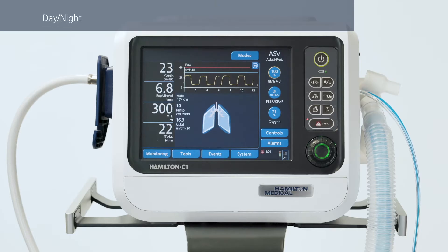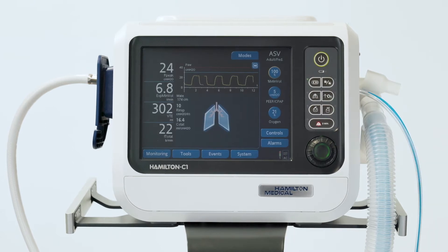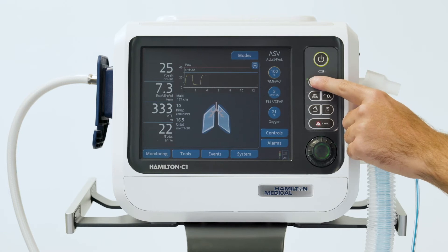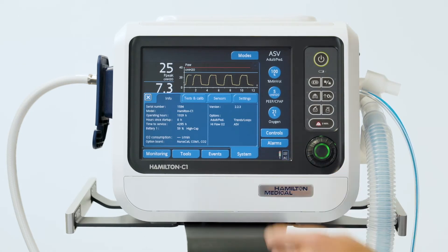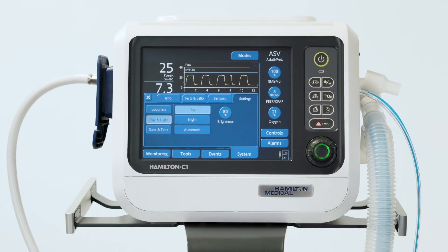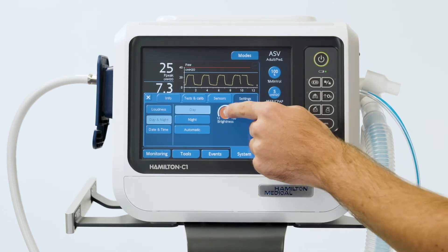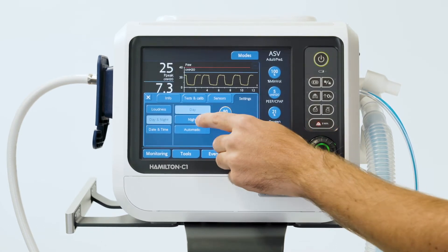Once you've started the ventilator, all the function keys are ready for use. To switch quickly between the display's two different brightness levels, press the day-night key. When the night setting is active, you'll see that the green indicator light next to the key is lit. You can always change the current settings for both brightness levels. Touch Systems and then select Settings. In the Day and Night window, you can adjust the display brightness for each mode, day and night.